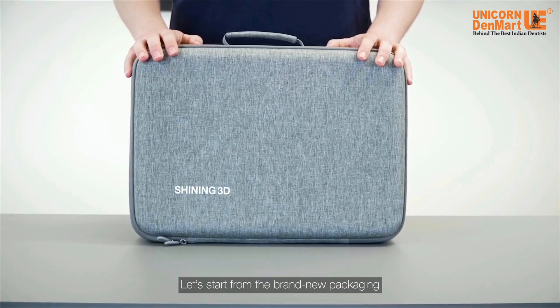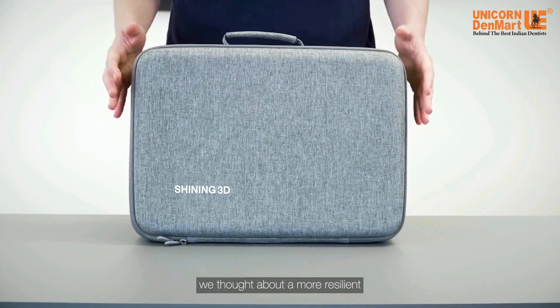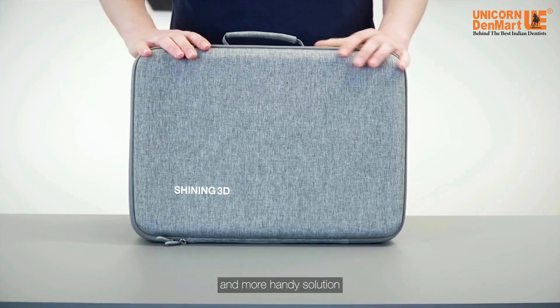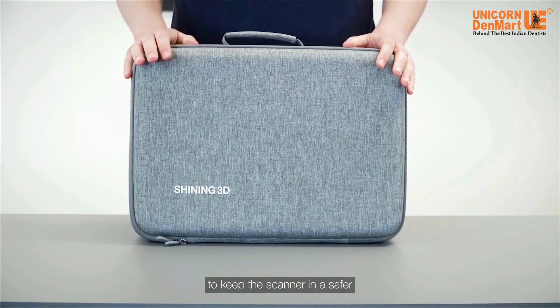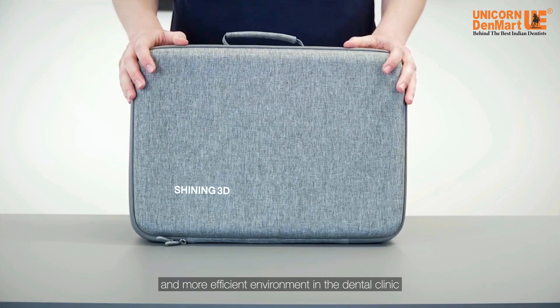Let's start from the brand new packaging available for Aural Scan 3. As you can see, we thought about a more resistant and more handy solution to keep the scanner in a safer and more efficient environment in the dental clinic.